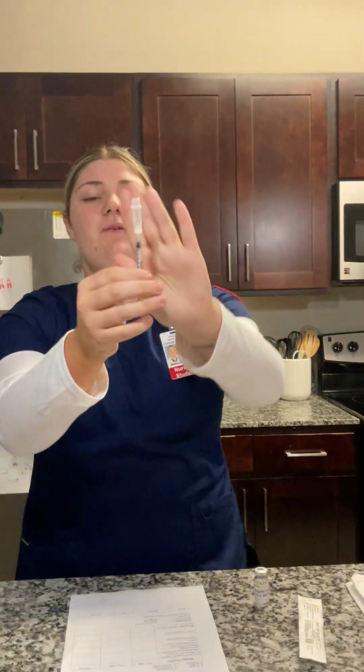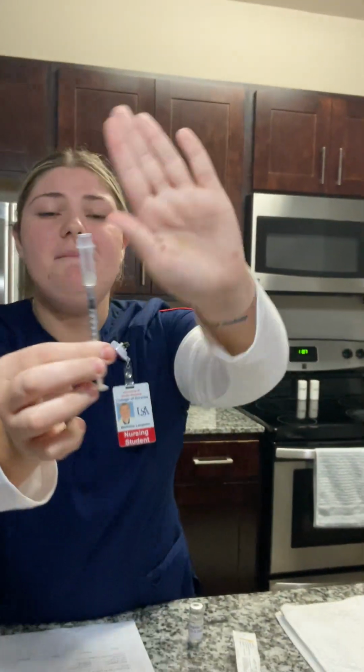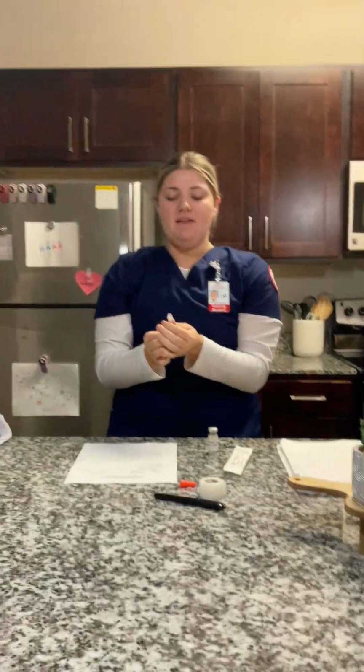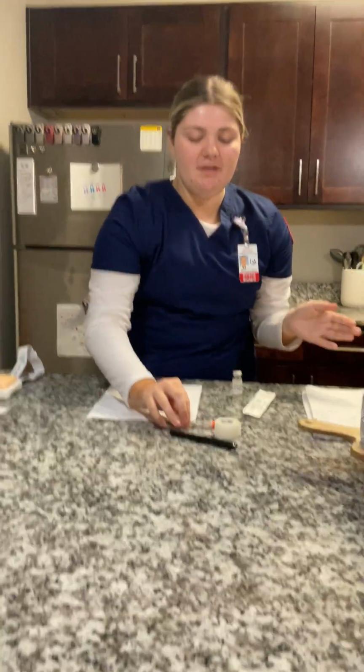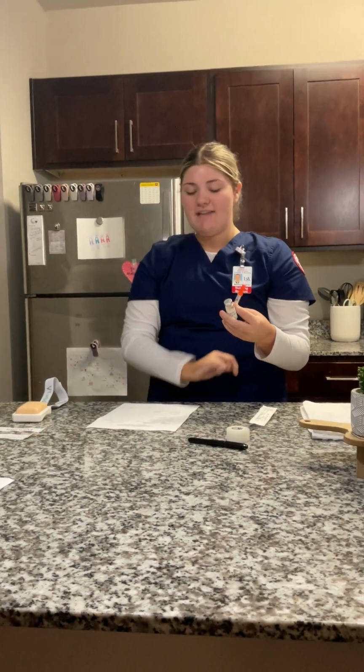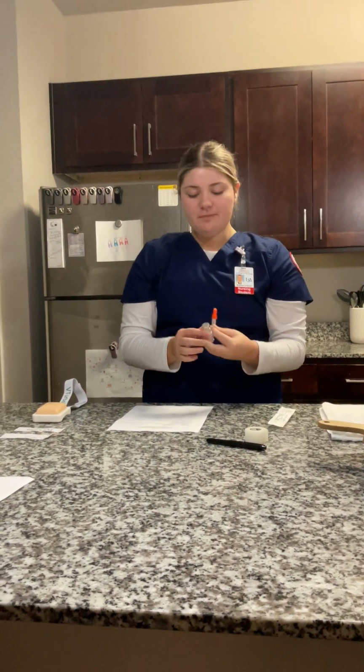Okay, now I'm going to show y'all. Might have to turn it a couple times. Okay, so now I'm going to put on the safety, and I'm going to do the scoop method that we learned. Okay, so now I'm going to take my MAR, my syringe, and my vial. So this is for Jaguar J. Jones, and it is Novolin R regular insulin, and that is what I put into my syringe.